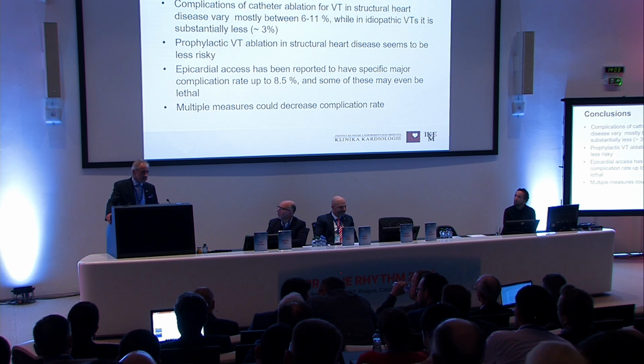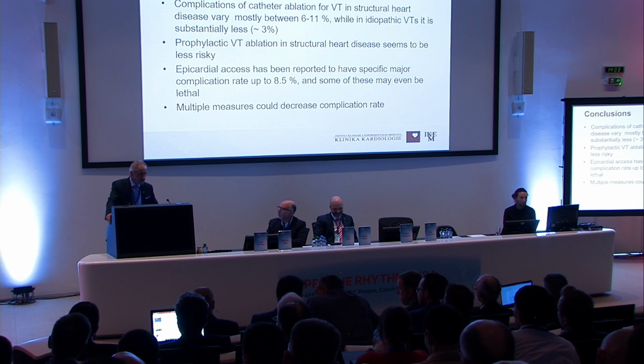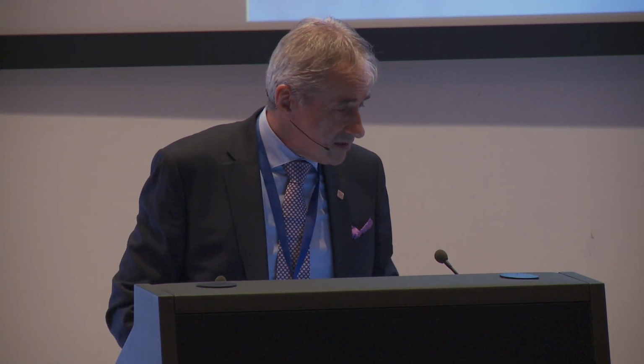Yeah, we have one study where we measured S100B protein, and in retrograde was higher than in transeptal. But generally, I liked retrograde for some locations of the substrate, like perimitral, for instance, or in aortomitral continuity, etc. We decide in every patient individually. Also, if the patient is older with peripheral disease, with a high probability having some plaques in aorta or calcified aorta, we always do transeptal now.